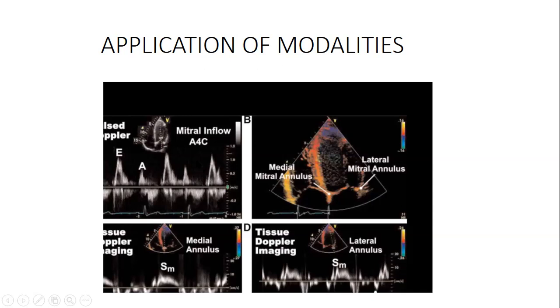The whole idea is to pick as much velocity as you can. So PRF cannot be separated from pulsed wave, and PRF cannot be separated from the Nyquist limit, because they help pulsed wave to pick higher velocities. And the moment you see an enveloping maximum velocity on the negative part, that is called aliasing.